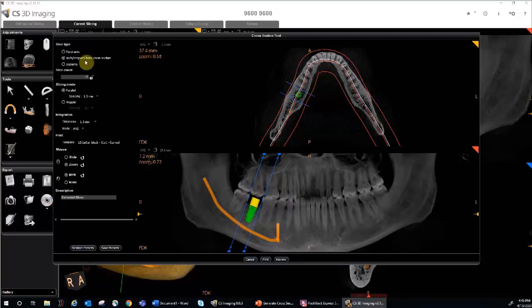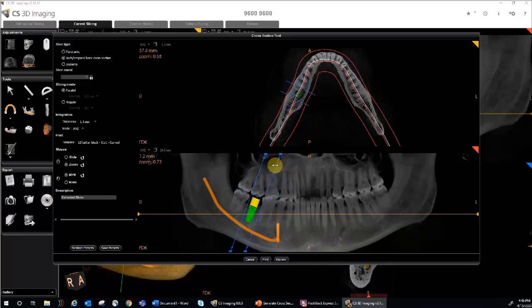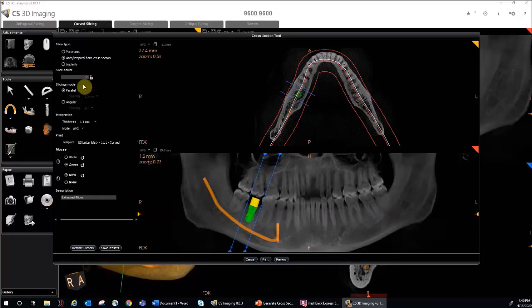You can also choose to lock the number of slices that you've chosen. This will prevent the distance that you've selected from changing, and you can move it back and forth and it will remain the same distance apart. But by locking it, it prevents you from doing further customizations. So I'm going to unlock it.